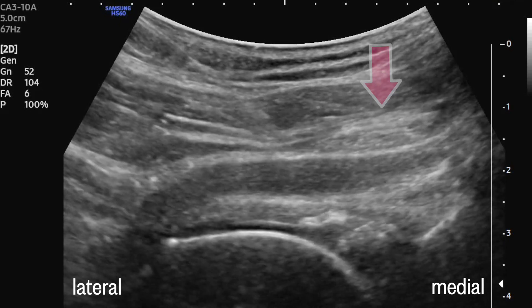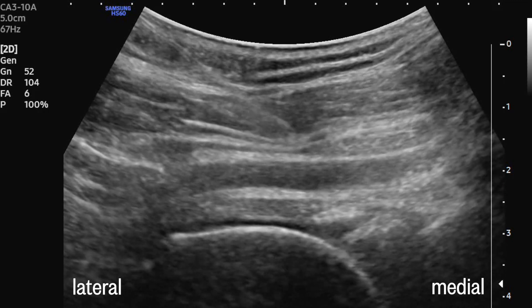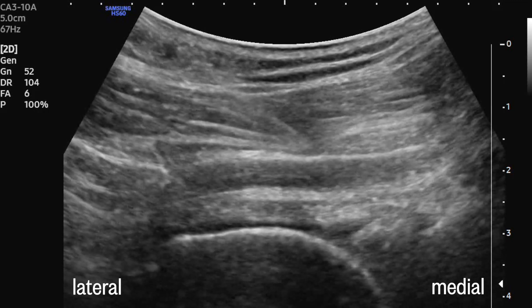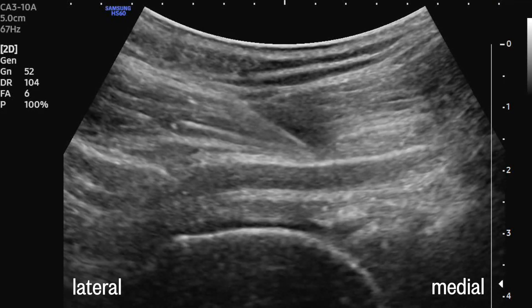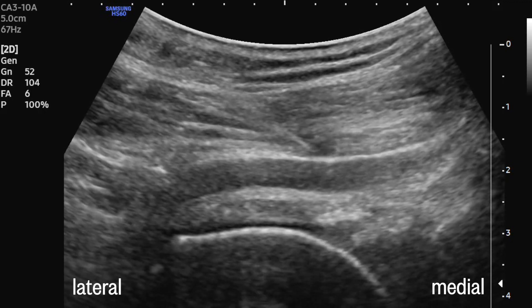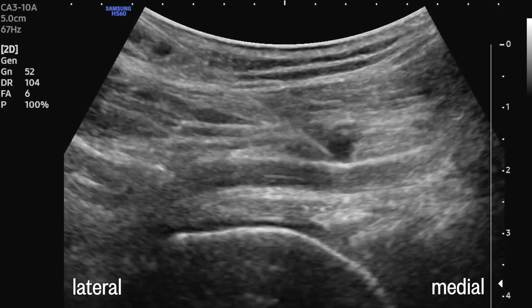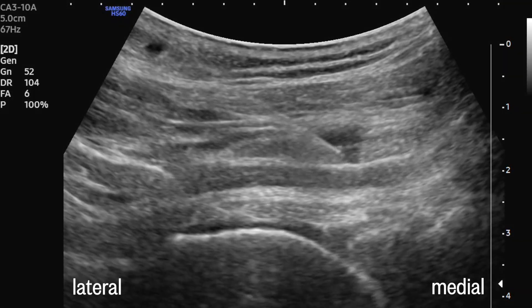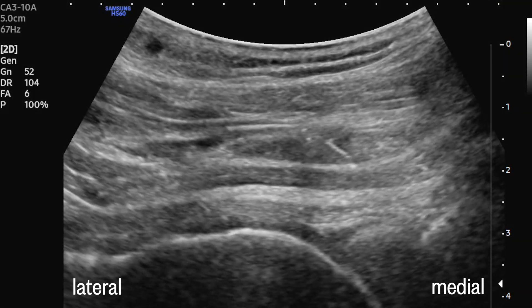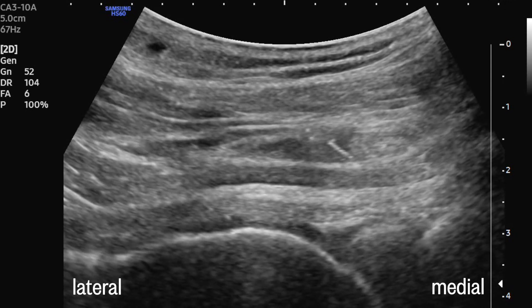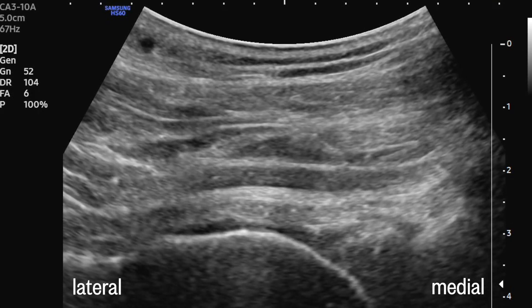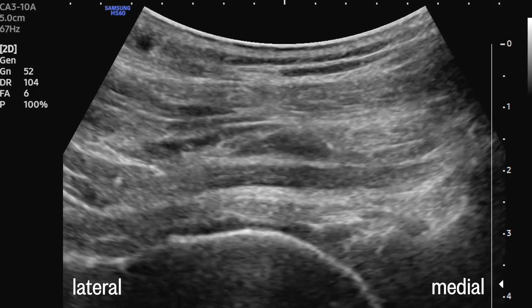The needle is advancing from the lateral side, aiming for the fascial plane just lateral to the nerve. Sometimes the nerve is just not that obvious, and for that reason we routinely use nerve stimulation as an adjunct to both find the nerve and to make sure we don't end up too close. We enter the plane and start with a test injection — you can see the plane unzippering here and the nerve being peeled off the surrounding epimysium. You can appreciate that the sciatic nerve truly lies in an intermuscular fascial plane, and these muscles are typically quite easy to separate with the hydraulic pressure of the injection.